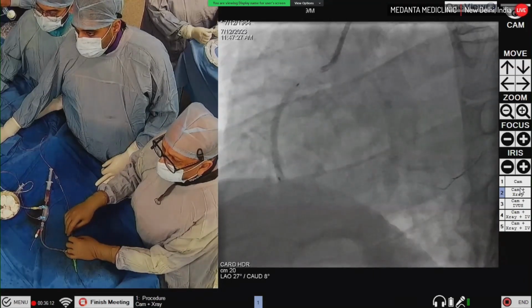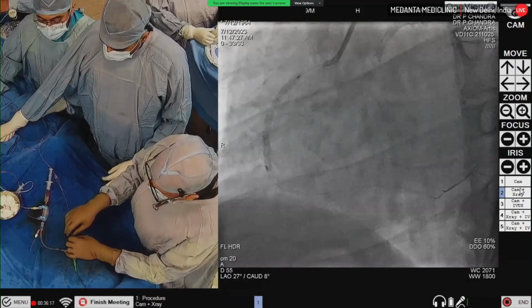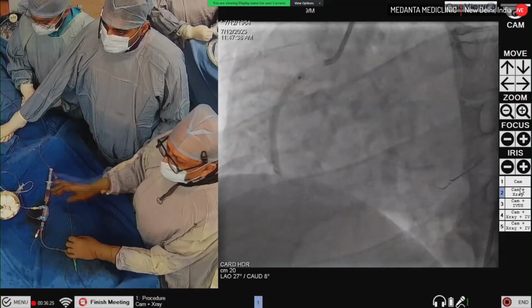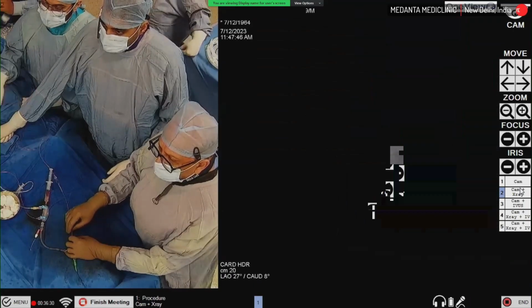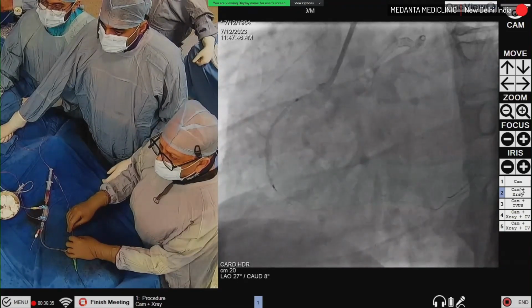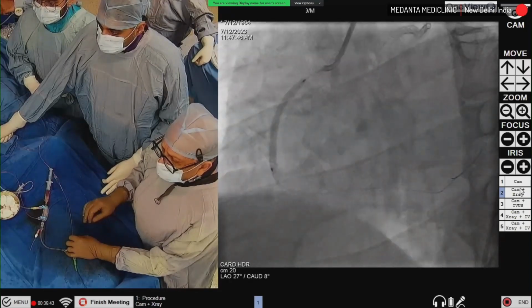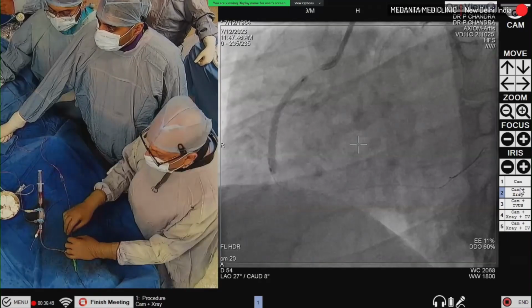So generally if you are implanting, definitely with a longer stent also, remain at about the implanting pressures for 20 to 30 seconds. Okay, deflate please. Okay. Now I'll go again at the same place. Go up. 1, 2, 3, 4, 5, 6, 7, 8, 9, 10, 12. Okay, so the size looks good to me. Fully expanded. Okay, deflate.